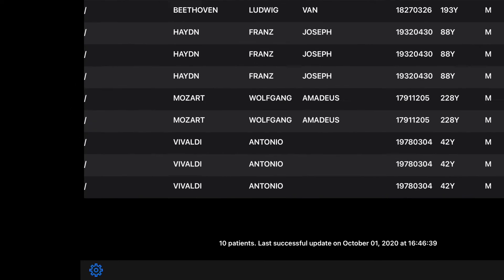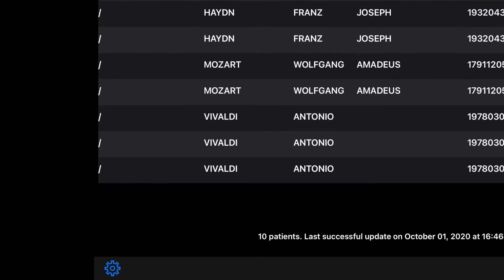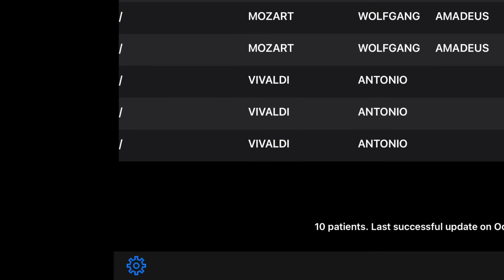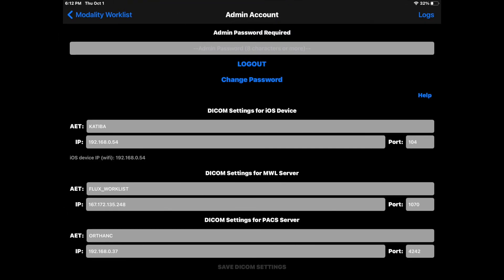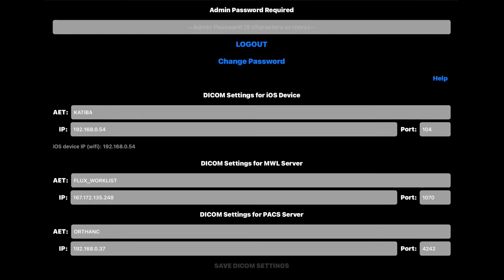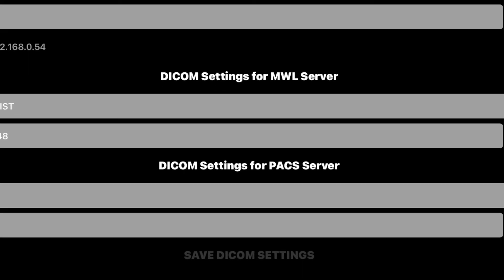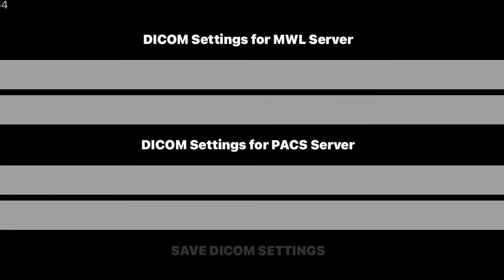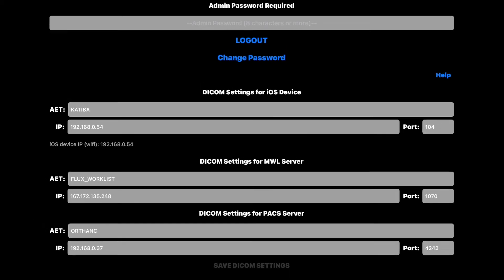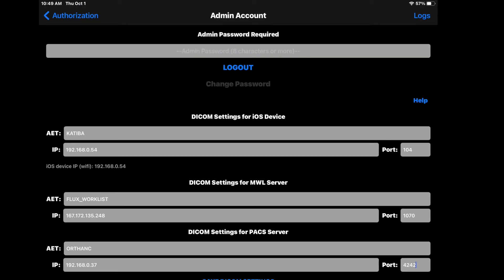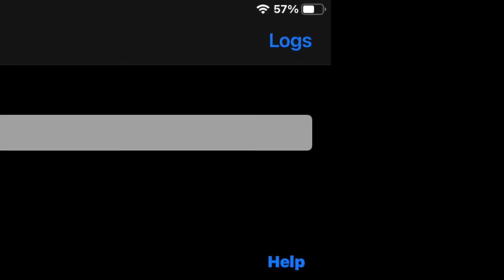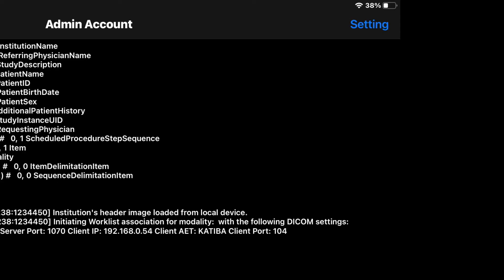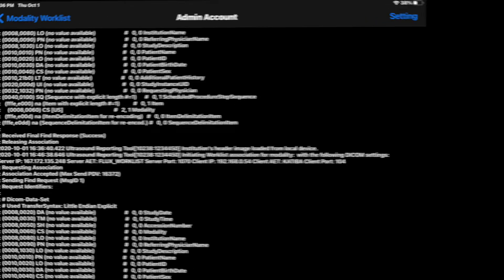If you were unable to get the worklist or if you get an error message, tap on the geared icon to go back to the DICOM page to make necessary corrections. If you change the settings, make sure to save the settings before leaving the page. You can also tap on Logs to check the network communications and to see what went wrong.